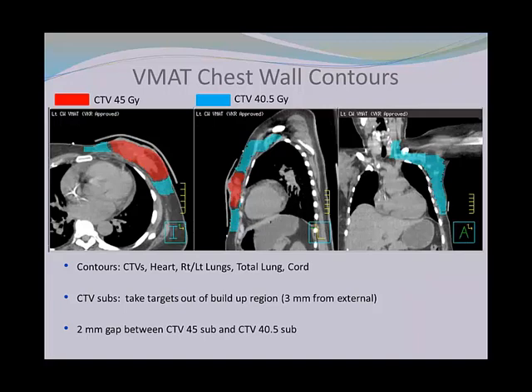For this case, I would like to use only 2 arcs to cover all my targets, but because of the low target, and also because the arm was cut off during simulation, I can't use the same rotations for the bottom as I could for the upper portion where the arm is, so I have to split into 4 arcs. Two arcs go for the bottom portion, and 2 arcs for the upper portion of the targets.